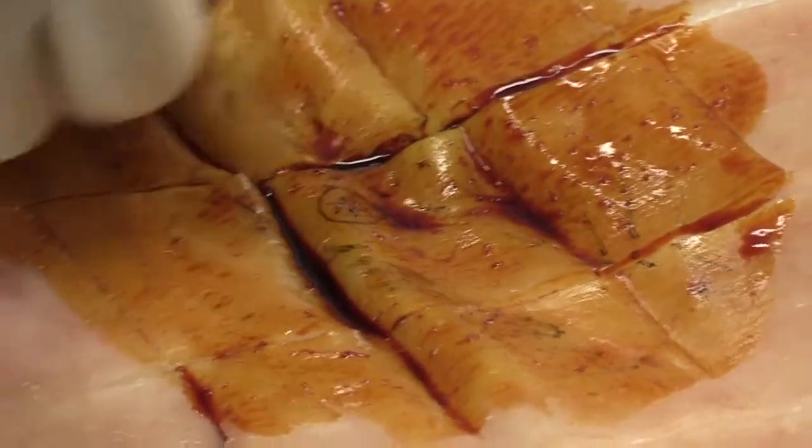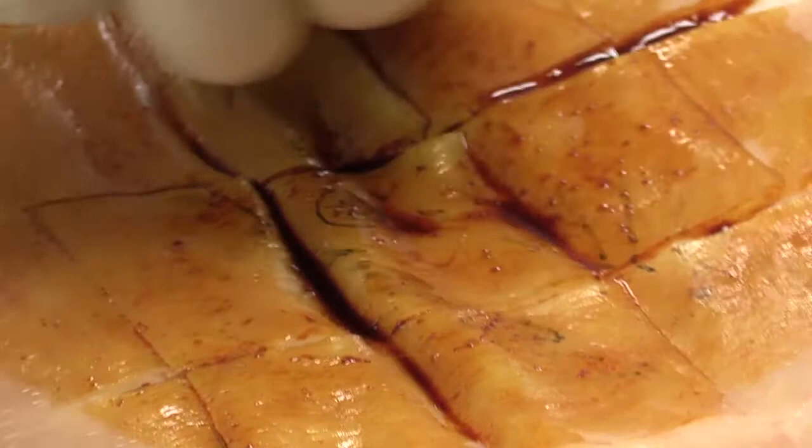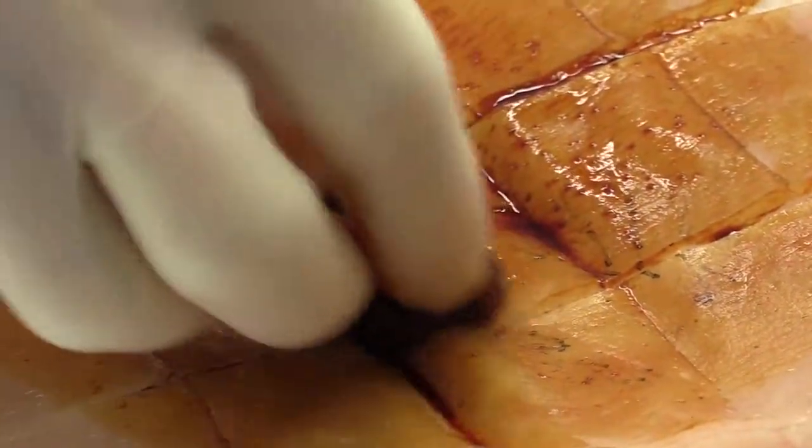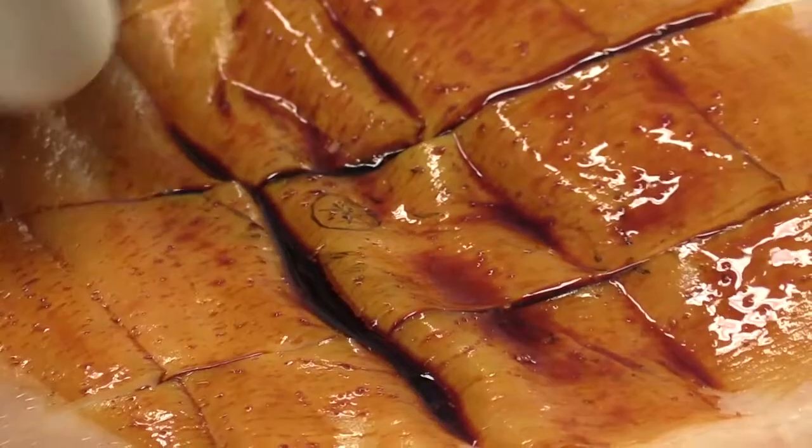The technique is not to return to the site in the center of the concentric ring, but merely to discard the swab, take a new swab, start at the point of maximal cleanliness, and again construct concentric rings away from the site that needs to be the most sterile.